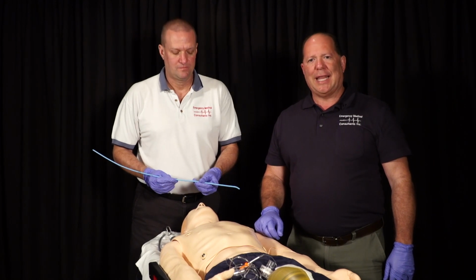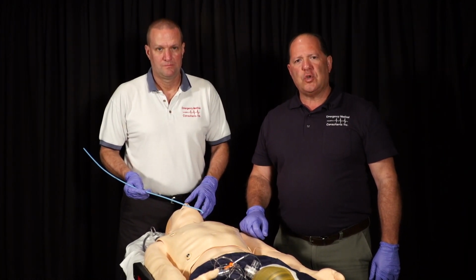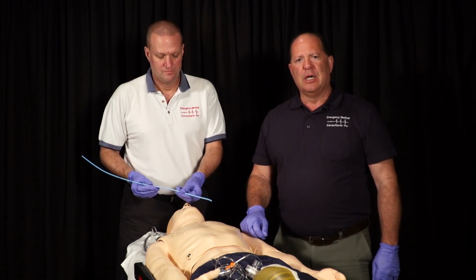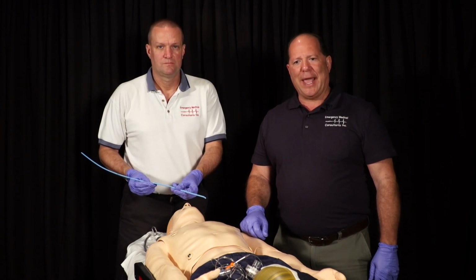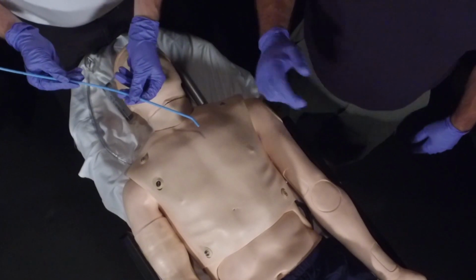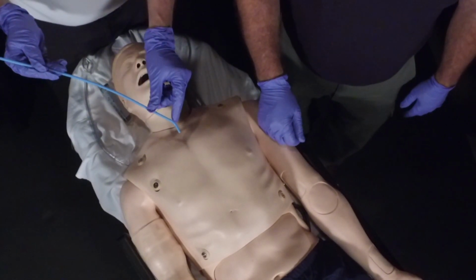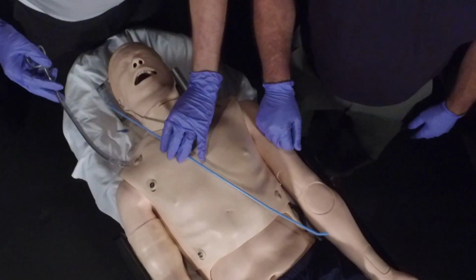The Bougie stylet is a great device for feeling your way into the trachea when visualization is difficult or impossible, whether it be from anatomy, from position, from excessive fluids in the airway, or any other area where you can't manipulate the posterior pharynx or the jaw to adequately see the glottic opening. Ideally, we take this device with a curved end. It's like a soft plastic stylet, and we're going to place our tracheal tube over that.